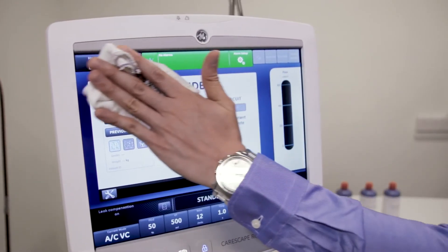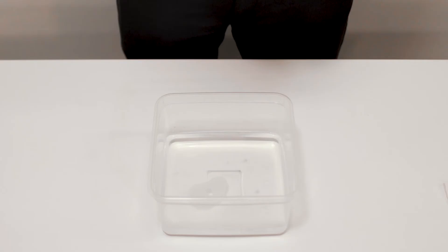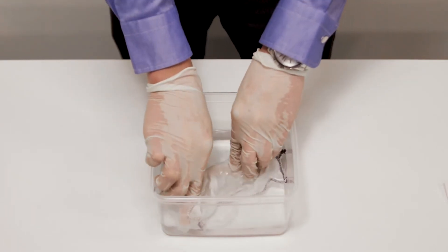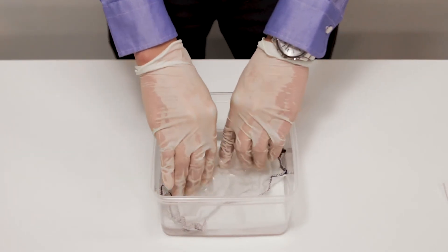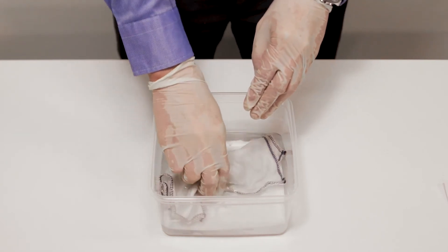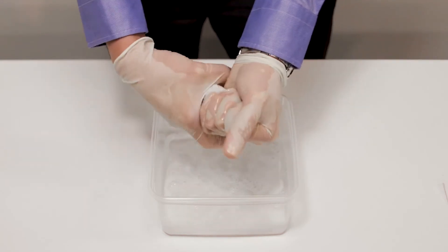Step 1: Use the wiping method to manually clean the parts. Step 2: Dip a soft clean cloth or towel in 70% denatured ethyl alcohol solution to saturate it with the solution. Step 3: Wring the cloth or towel until it does not drip.